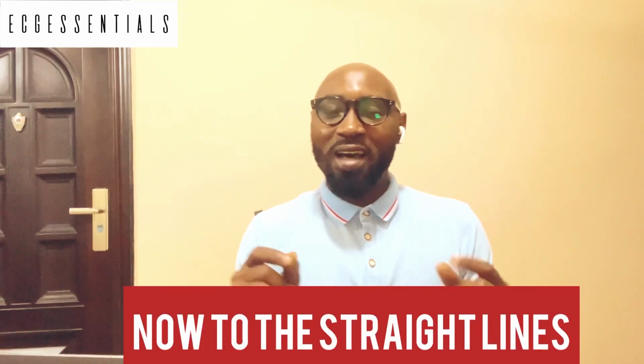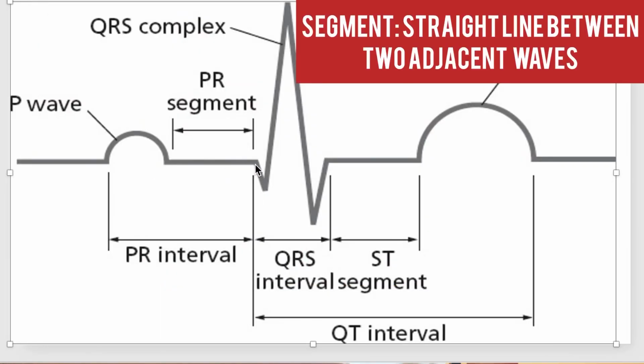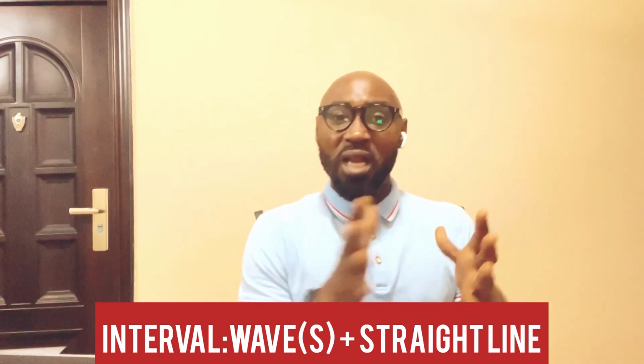Having looked at these deflections, we want to delve into the straight lines. At this point, we want to differentiate between a segment and an interval. Whereas a segment is just a straight line connecting two waves, the interval is a little more than that. The interval encompasses at least one wave plus the connecting straight line. So an interval will have at least one wave plus a connecting straight line, whereas a segment is just a straight line connecting two waves.